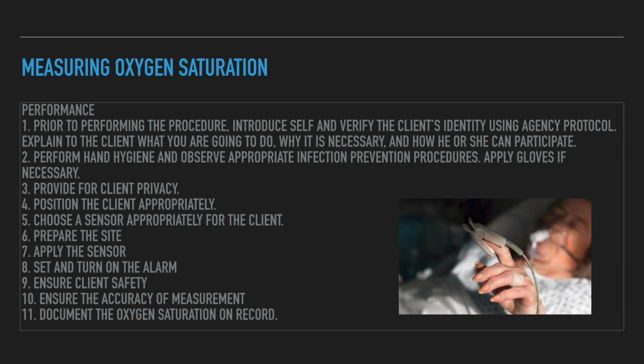Ensure client safety. Inspect, move or change the location of an adhesive toe or finger sensor. Inspect the site for irritation from the adhesive sensor. Ensure the accuracy of measurement. Minimize motion artifacts by using an adhesive sensor or immobilizing the client's monitoring sites. Last, document the oxygen saturation on the appropriate record at designated intervals.